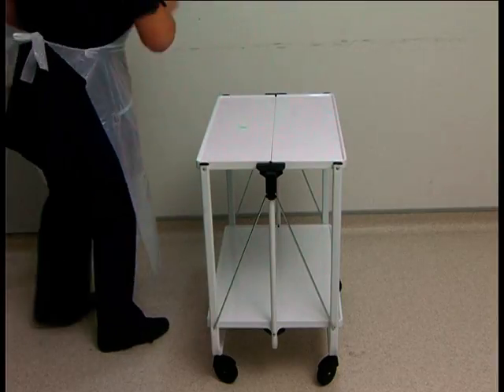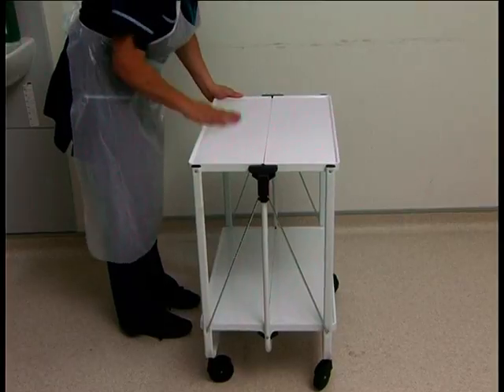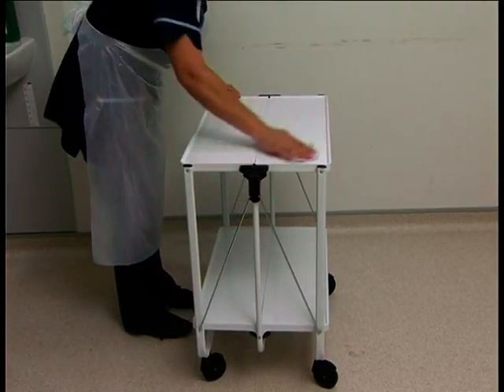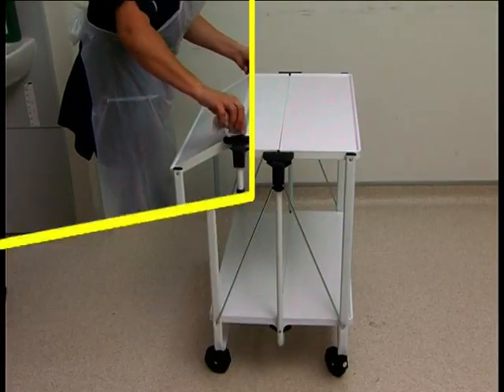Prepare the trolley as already shown, using washing up liquid and water. Wash, rinse and dry both surfaces of the trolley and any other smooth, hard surfaces that you will be using to put unopened equipment on.